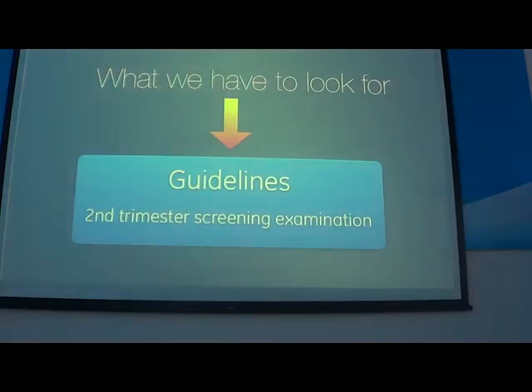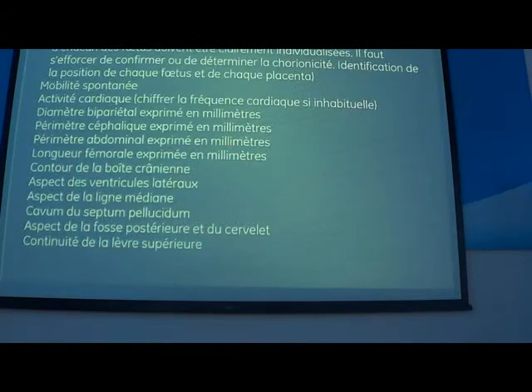I don't know here if you have your own guideline, but I will show you the guideline in France and from the UK. Tôi sẽ trình bày với các bạn cái guideline hướng dẫn trong cái siêu âm ở quý 2 của Pháp. And this is the guideline what we have to do in France. So this is in French. I will put it in English.